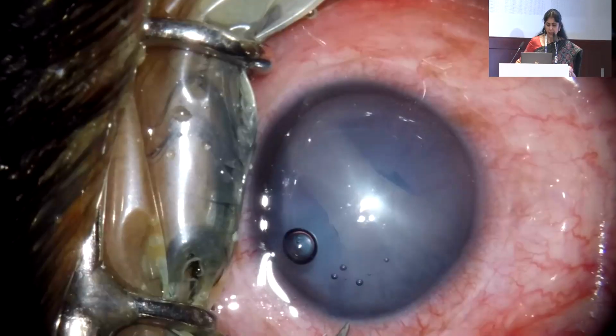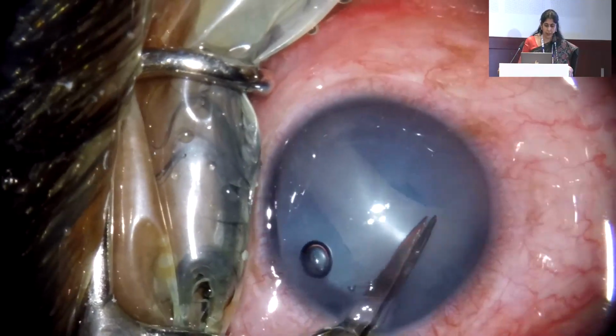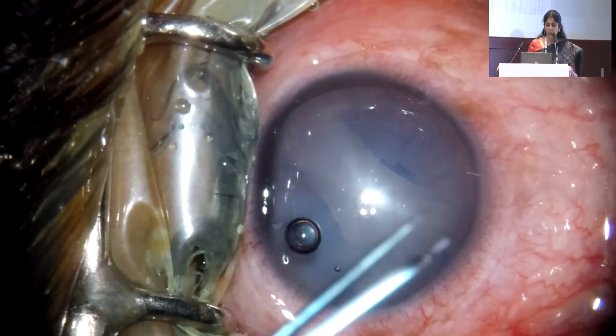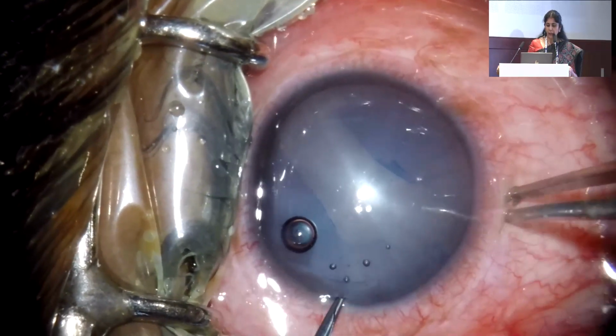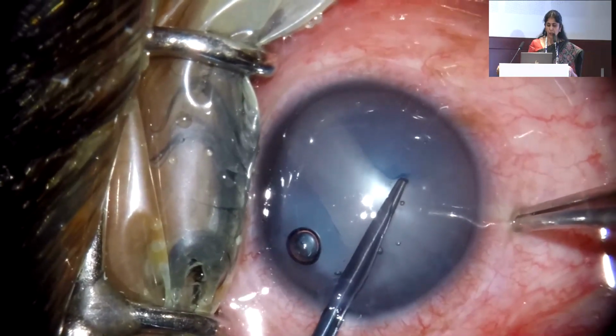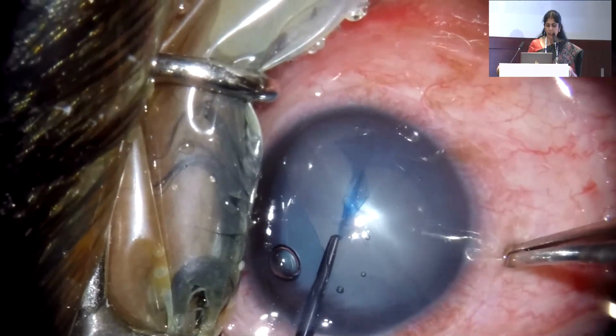One can handle these cases by, you obviously don't have the chance of doing a rexus now. It's not a continuous tear, but you can create more space and make a nick in the anterior capsule flap and then just close it. So this way you have at least a circular space in the center.